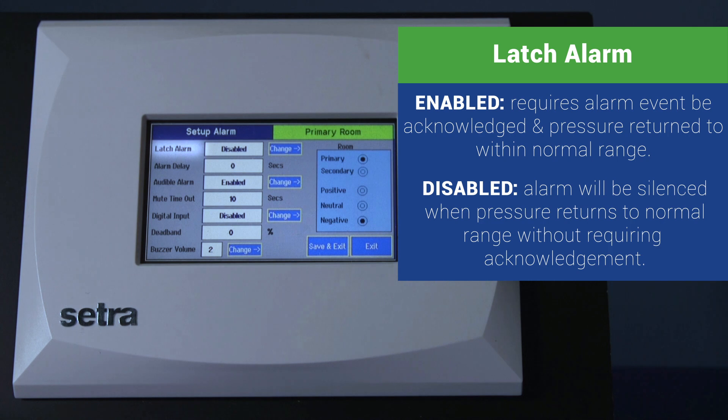Latch alarm — disabled. In this mode, the alarm will be silenced when the pressure returns to normal range without requiring acknowledgement.